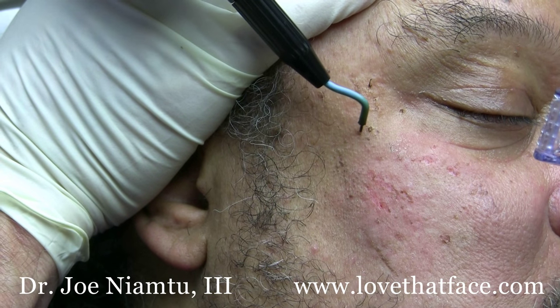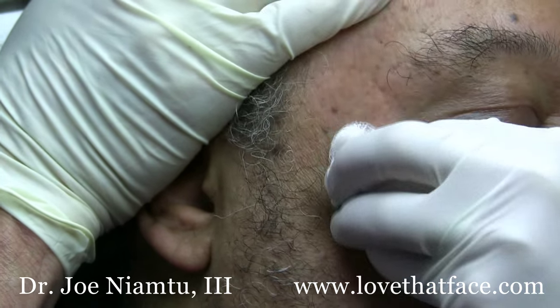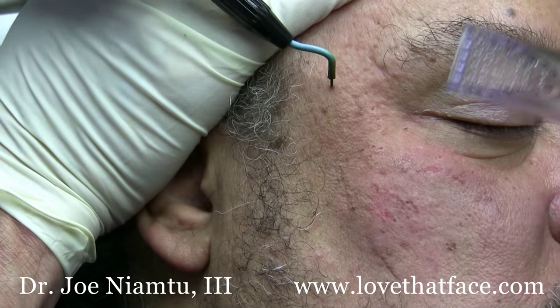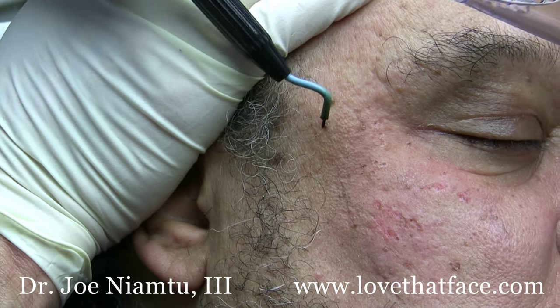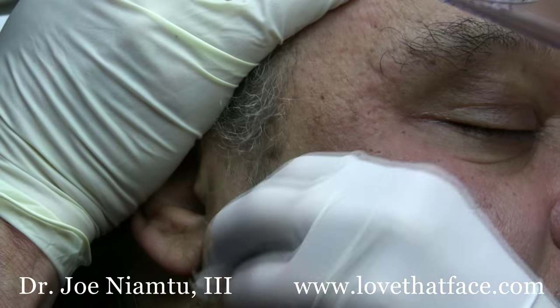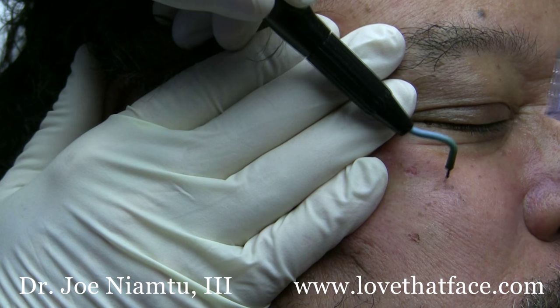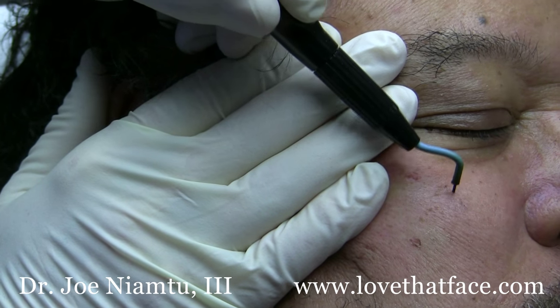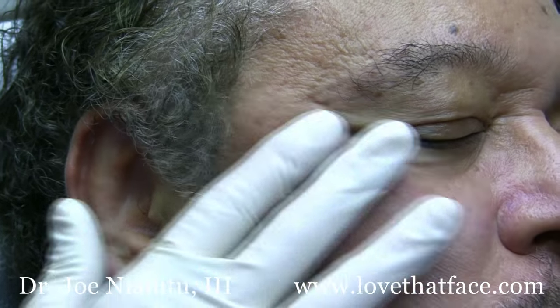These really tiny little DPNs are extremely easy to treat and they're not painful. It's not uncommon that we may do several hundred of these on a patient at one time. What you do is just ablate and then the assistant wipes the char off, and using the lowest setting possible and being conservative gives the best cosmetic result.